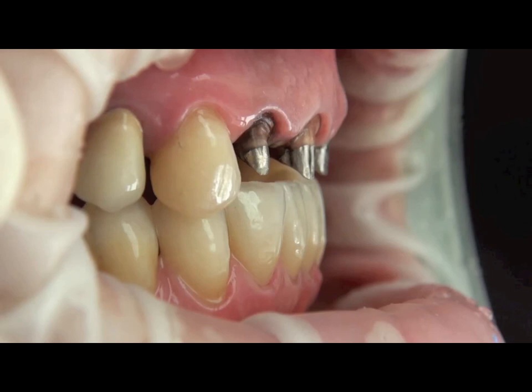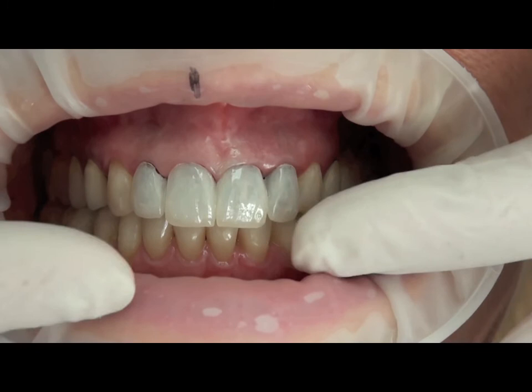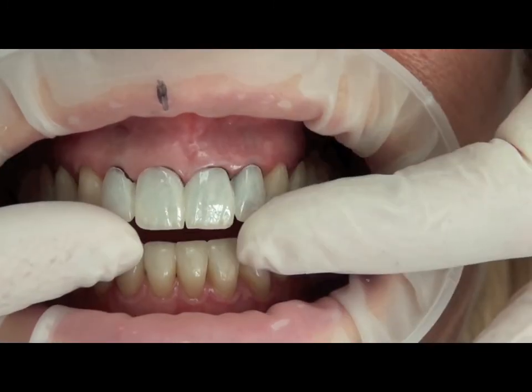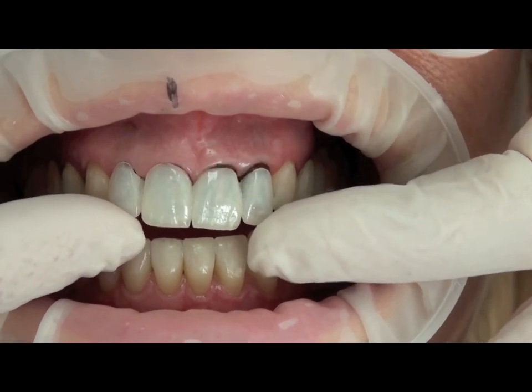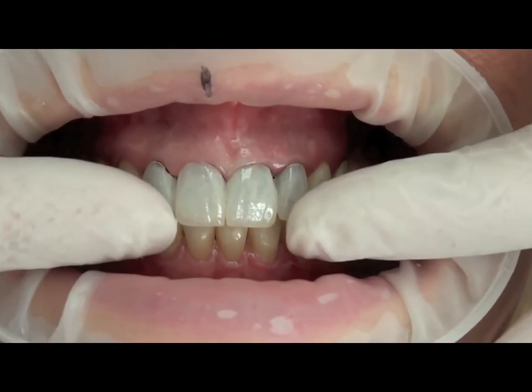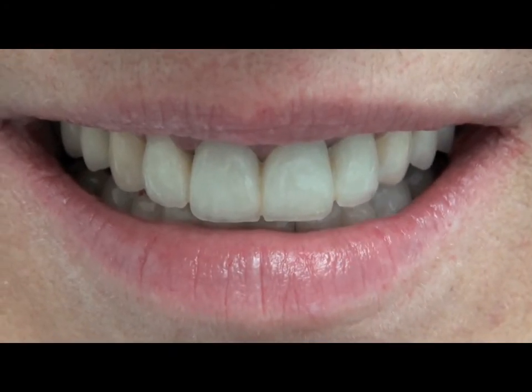A short movie to show that in this old case we have removed all the restoration, and once you put your provisional in, you go in front of the patient and you can see that you can be guided by the occlusion like that. But if you still want to change the axis, you have the possibility to do it, because it's absolutely large cervically. But of course, most of the time it's easy because you have the perfect position and you reline in this particular way, just following the occlusion of the patient.